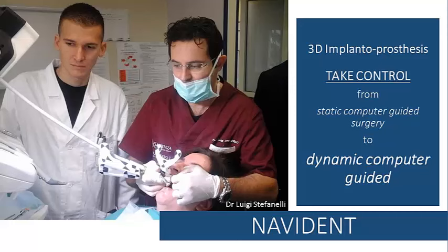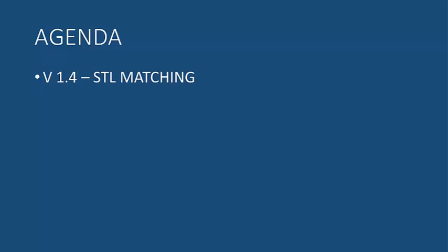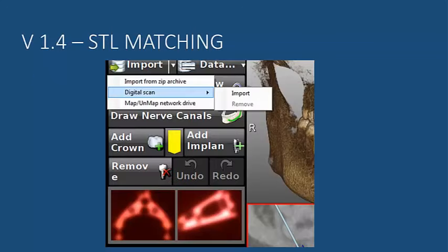This video features the new version of Navident 1.4, specifically the STL matching feature, which is quite important for Navident. You can activate that feature using Import, then Digital Scan, and then Import.